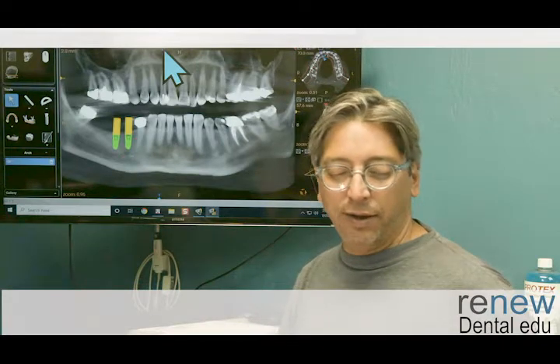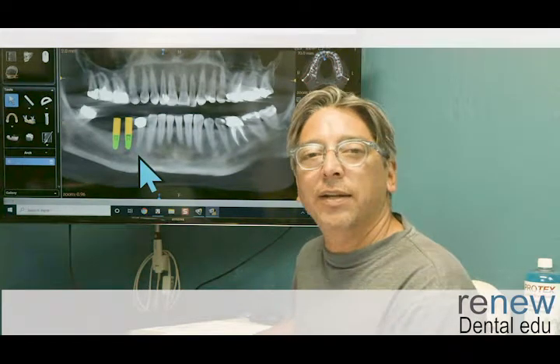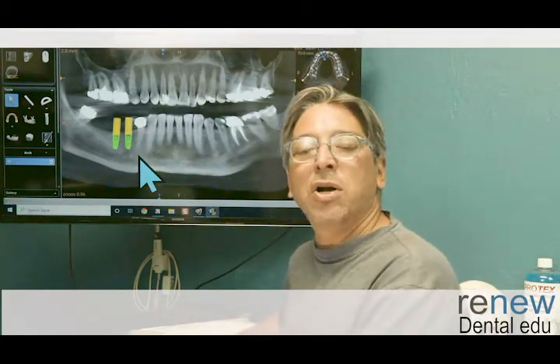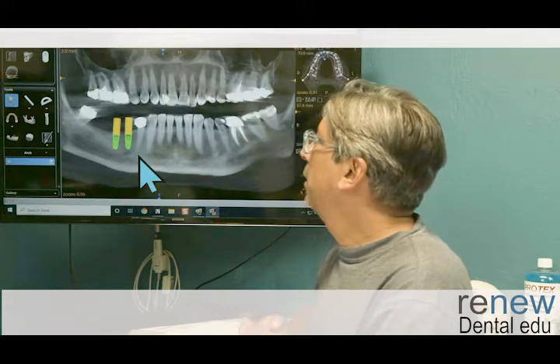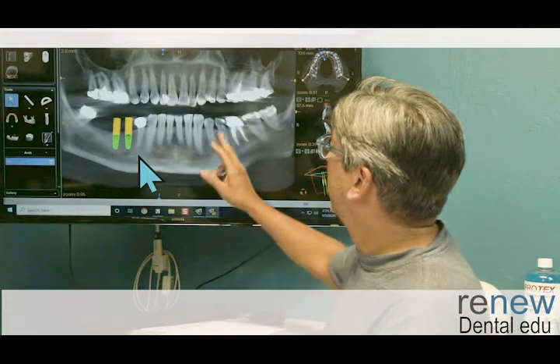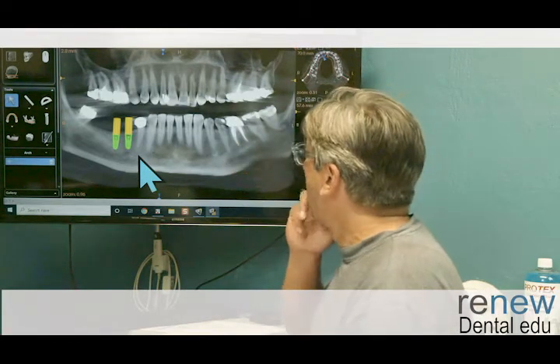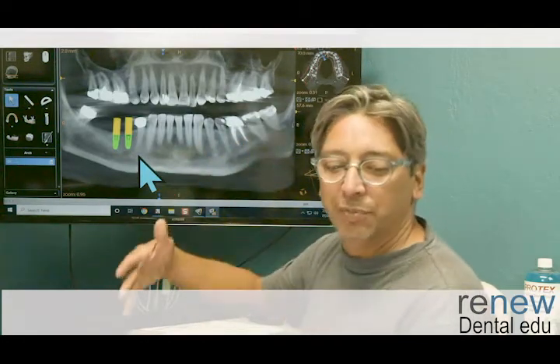We are looking at a case here, just the lower right side. This is a fairly typical situation. I call this one green light because there's a lot of greens going on in this case, looking at that bone structure, constriction, bone quality, ridge height, that kind of stuff. It's all kind of light greens. And probably on this side as well, that root canal treated tooth on number 19 is probably not going to last forever either. So this is going to probably happen over here. So you kind of got a future built into this.